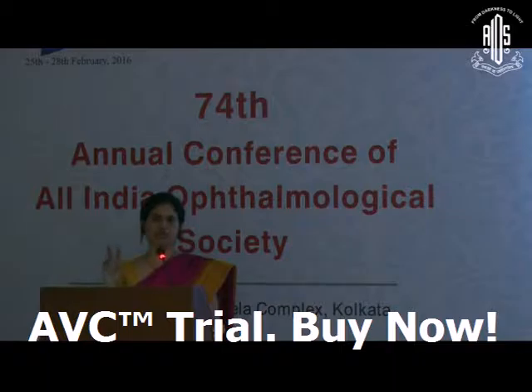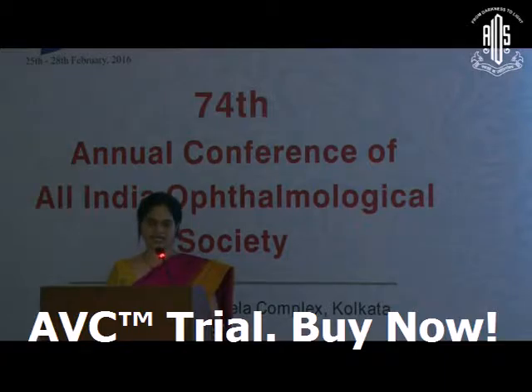So basically there are two components: a tube and a plate, and this long tube is placed in the subconjunctival space. Whether we like it or not, we have a foreign body in the eye, placed in whichever quadrant. There are constant eye movements, which make the tube inside the eye a very dynamic thing. It is mostly used in difficult glaucomas, in eyes with scarred conjunctiva, and even in children as a second or third procedure.